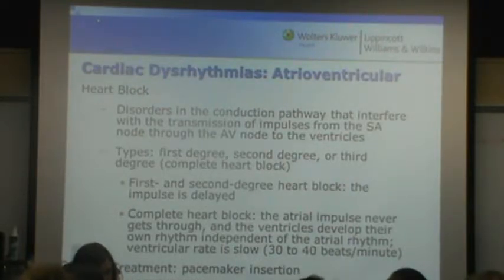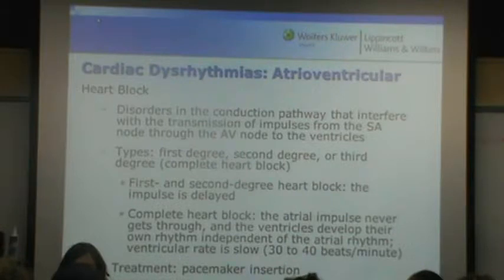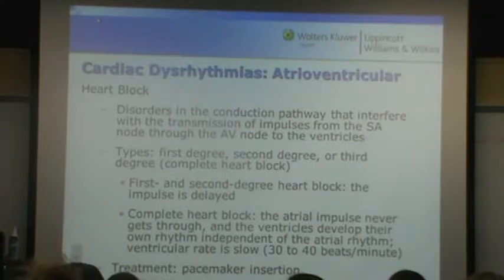I very rarely ever see a 2-to-1. So the SVT doesn't have to be very much. Yes, it can have. Flutter is regularly regular, and it'll have a definitive sawtooth pattern, right? That's a 2-to-1 flutter on that strip right there, if y'all want to look at it. Although I've very rarely ever seen a 2-to-1 that runs that long.